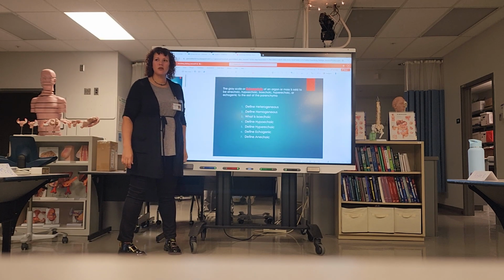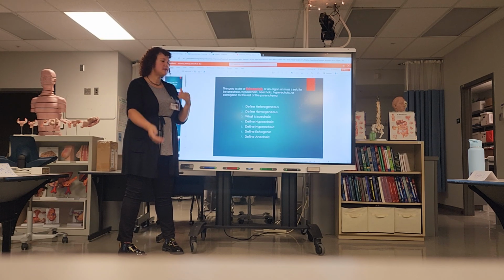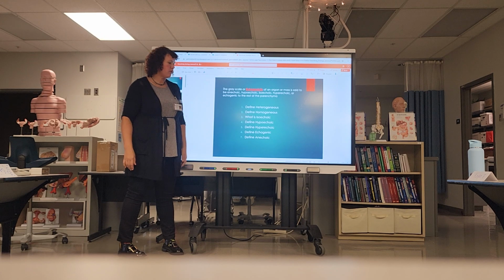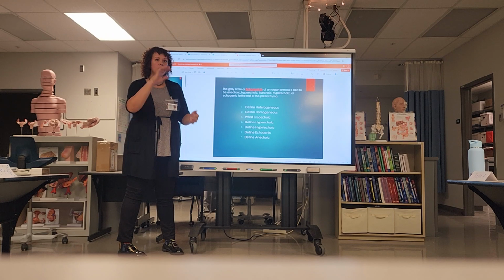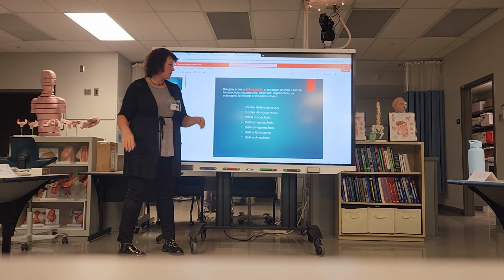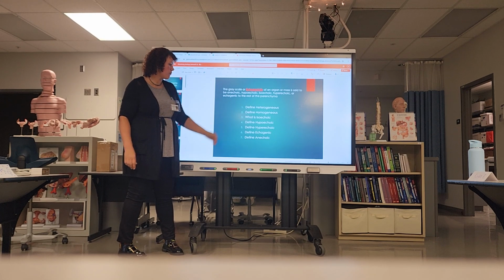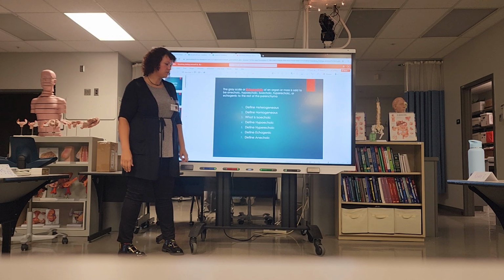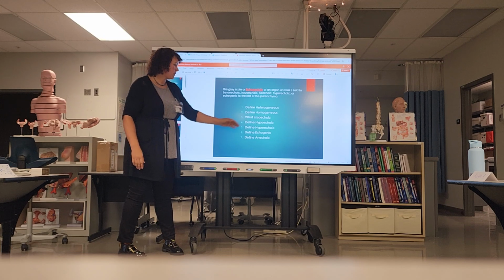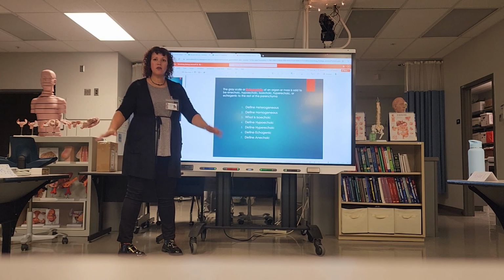Alright, what about isoechoic? Similar in texture to surrounding. That's right, yeah. When we're comparing two echo textures and they're the same, it's iso. Alright, what about hypoechoic? Low echo. Less echoes, yeah. So it's going to be darker than what you're comparing it to. What about hyperechoic? More echogenic, yeah. So more echoes, it's going to be brighter than what you're comparing it to. Echogenic, yeah, same thing as hyperechoic. And then anechoic. Yeah, without echoes, it's going to look black.